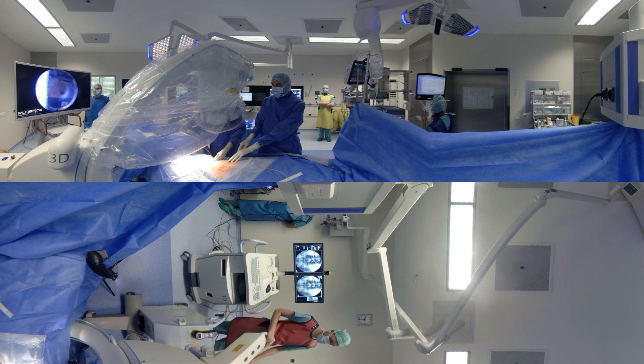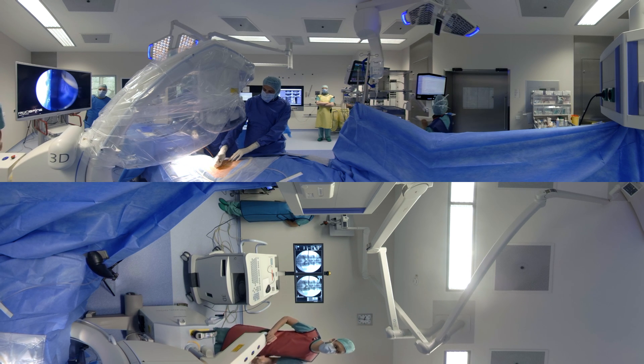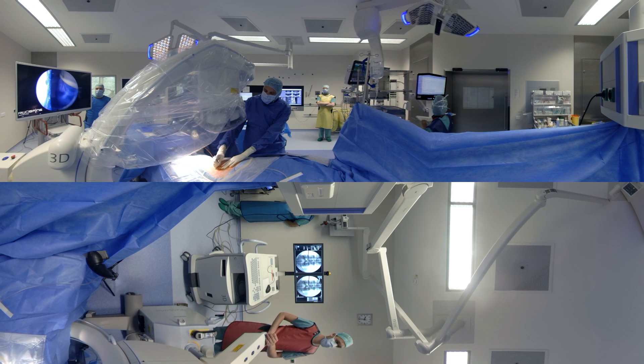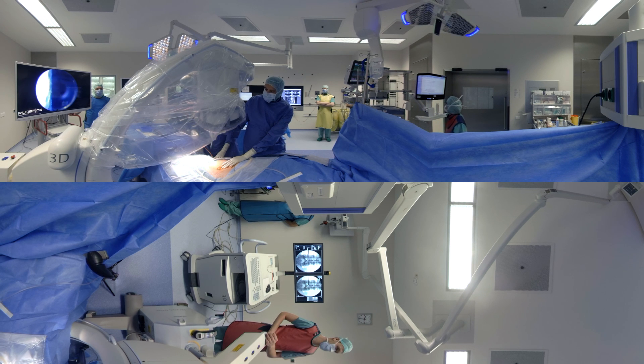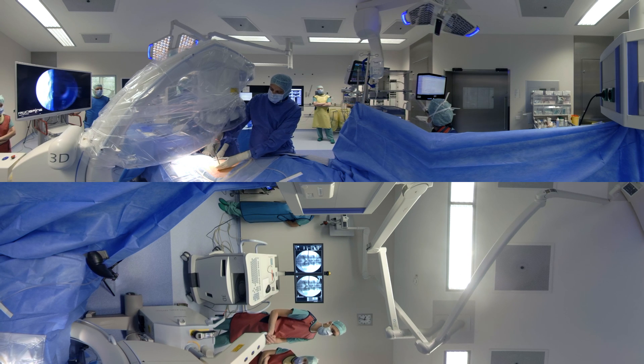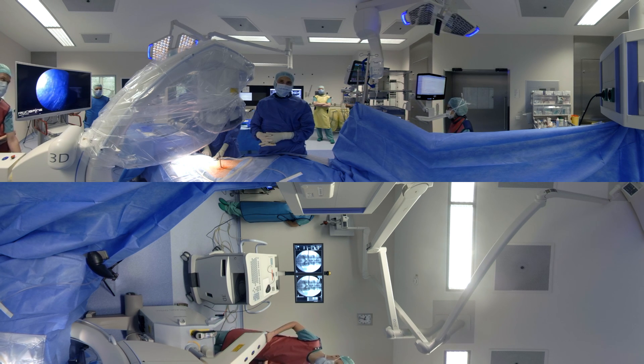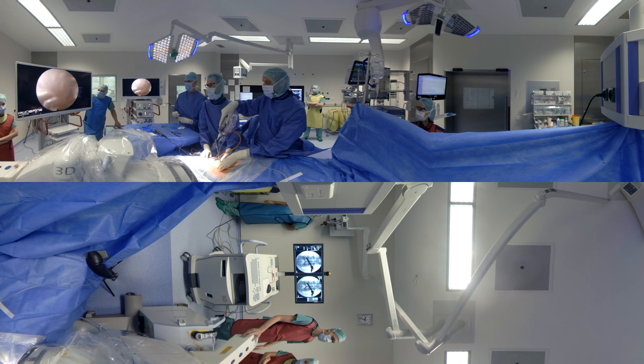Let's see the interlaminar window L4-5. This is where we will make our skin incision — just a small 5 to 6 mm skin incision. We go down right next to the spinous process and we only incise the fascia so that we can go in with the next instrument, straight down to the interlaminar window. That's our entire access, whether it's a 50 kilo or 150 kilo patient — virtually the same access and takes 30 seconds to get down to the spine.